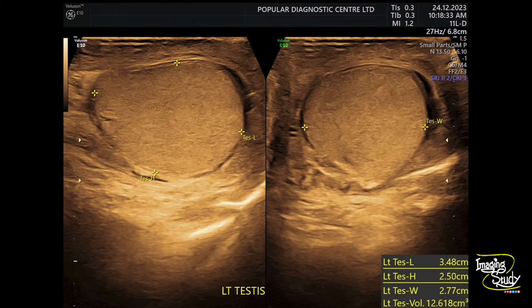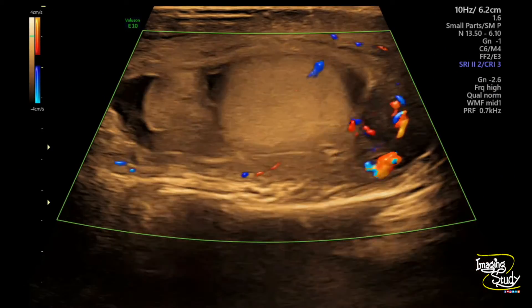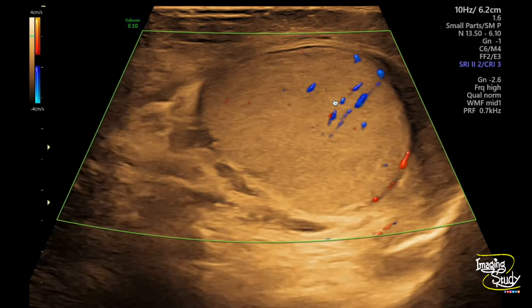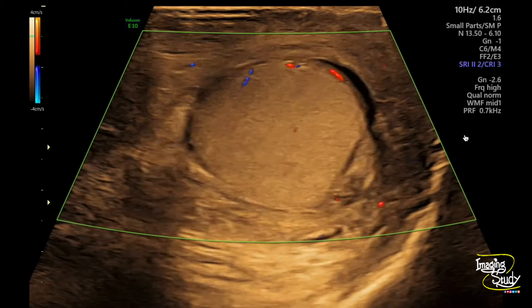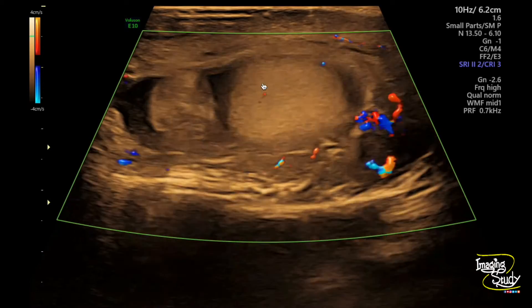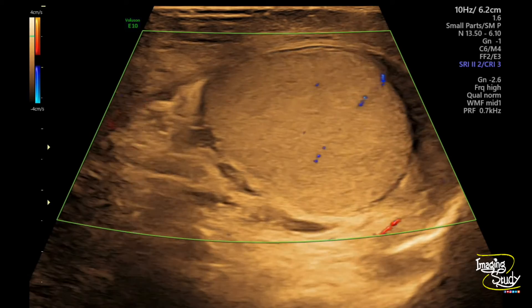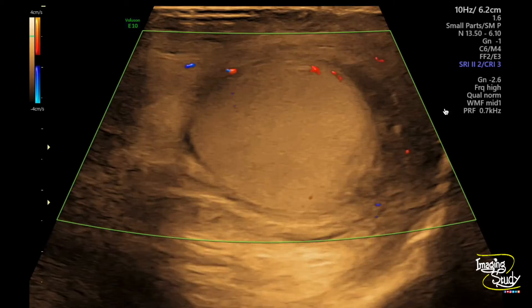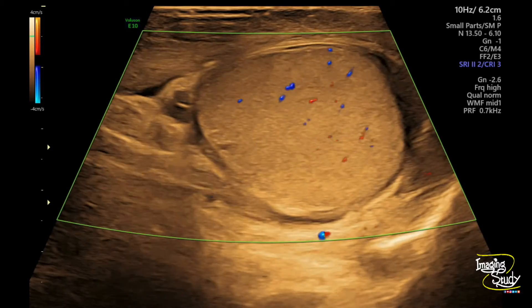Now let's put some Doppler over this testis. We'll go with the normal one first. This is the left testis and we have adjusted our ultrasound machine. Always adjust the normal testis vascularity first, then compare it with the abnormal one. We have adjusted the vascularity and PRF settings, so we'll now compare it with the right one.